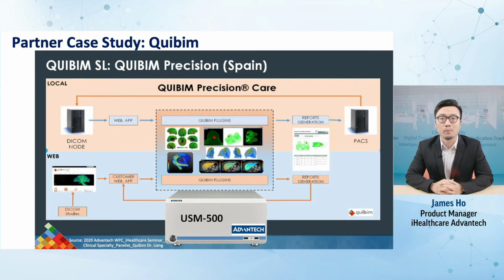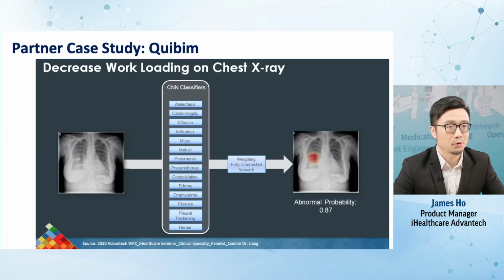AI-driven software can be programmed to accurately spot signs of a certain disease in medical images, such as MRI, X-ray, and CT scans. Using such tools, doctors can diagnose patients more accurately and prescribe the most suitable treatment in a short-term time span. Third, personalized treatment.